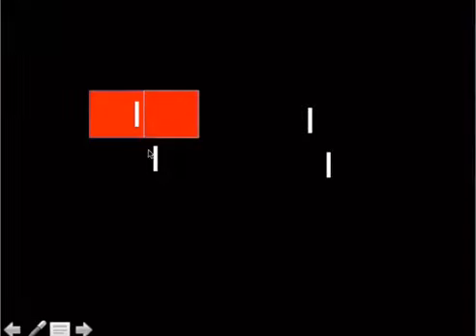If you've got more voxels, in this case 4, versus one voxel, the one with 4 voxels, each showing an individual thing, lets you tell there are 2 different things. But in the big voxel, the signal just gets averaged together and looks like there's 1. So more voxels, better spatial resolution.